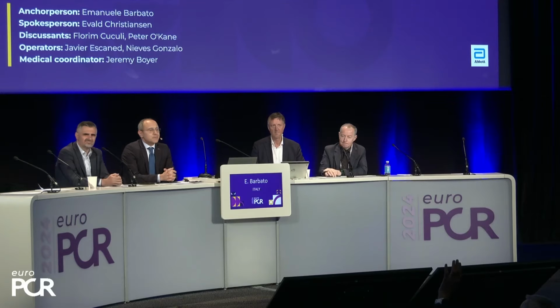Who would go with a one stenting strategy? Of course, the obvious answer would be, I want to see imaging first. I agree with you, but assuming that this is the information you have, who would go for one stenting strategy? Raise hands. Who fears, of course nobody likes it, but who fears that we are ending up with a 2 stenting strategy? Raise hands. So 2/3, 1/3.